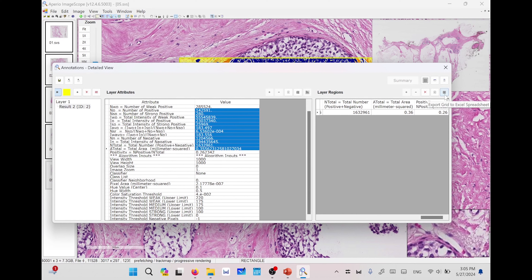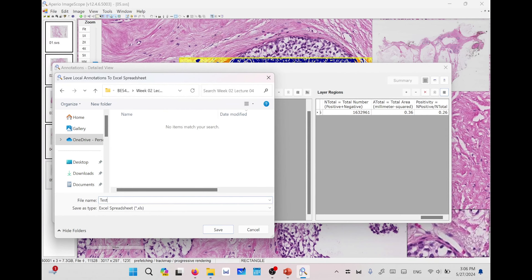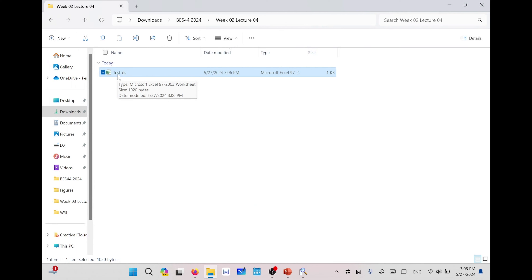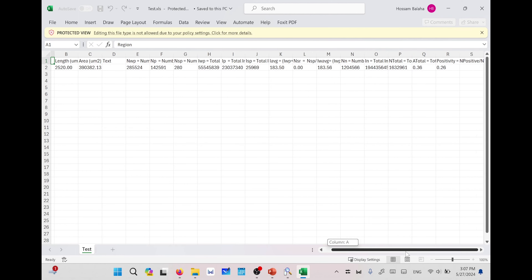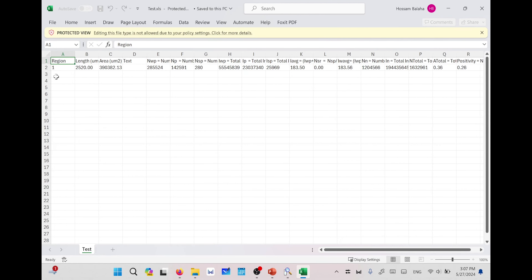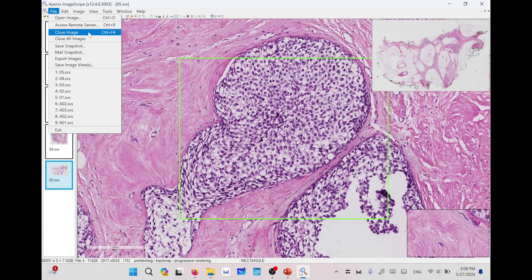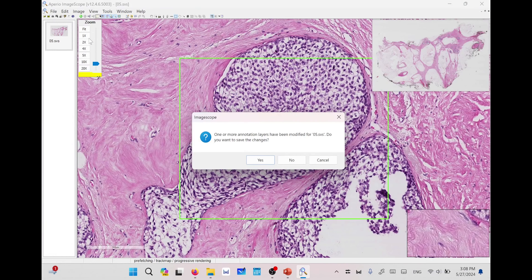These features can be exported using the Export Grid button to an Excel spreadsheet. For example, exporting as test will save test.xls — an older Microsoft Excel format. Opening it presents the different features for each region. If you have 25 annotated regions, you will have 25 records that can be used as features for your classifier or model based on numerical features instead of images. You can close all images or close a specific image. If you have manipulated an image it will ask if you want to save your annotations — press Yes to save or No to discard.